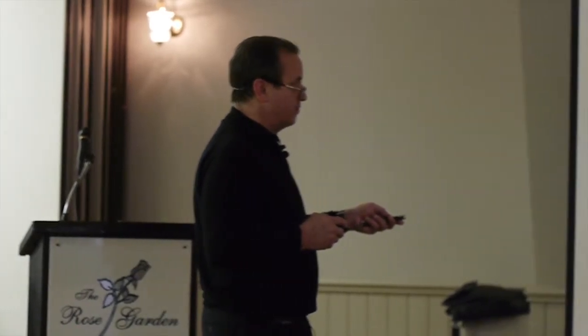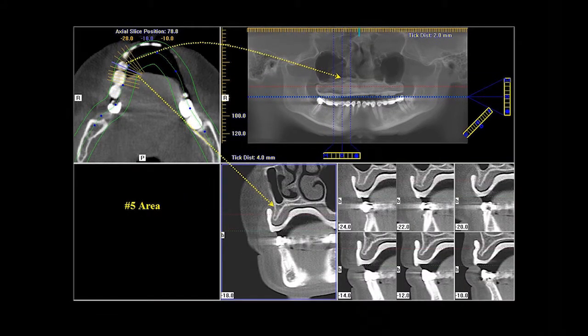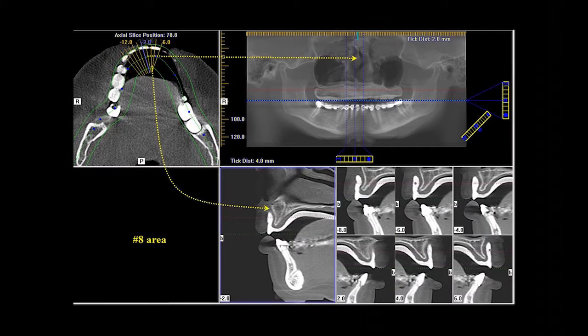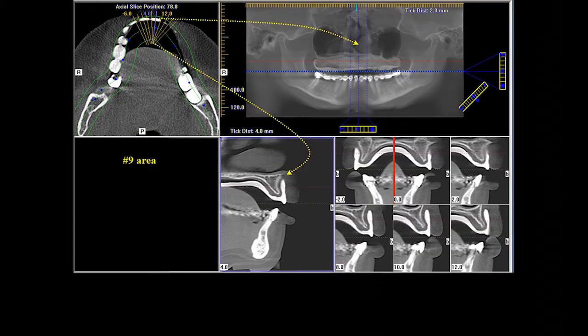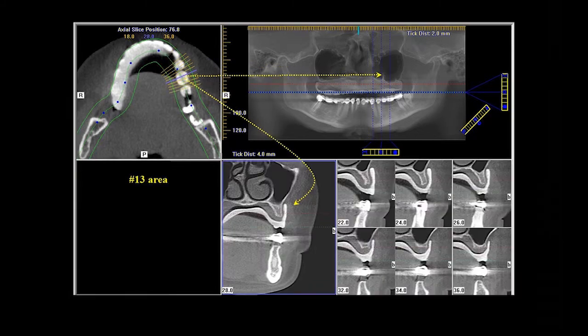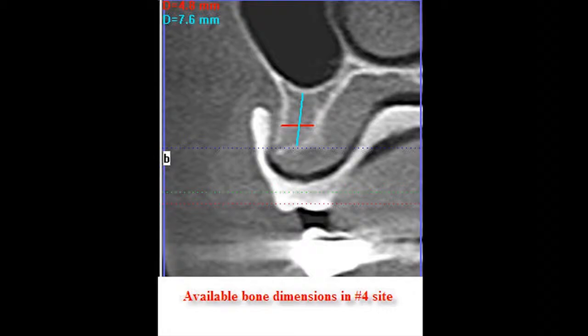And so when we start up in the upper right quadrant in the area of number 3, not a lot of bone. Here we are on number 4, a little better, really a lot better, I guess. Number 5, not too good, pretty thin. Number 6, pretty thin. 8, better. 9, better. This is 11, thin again. 12, thin. 13, a little better. And 14, not good. So then we're going to go in and measure all this.